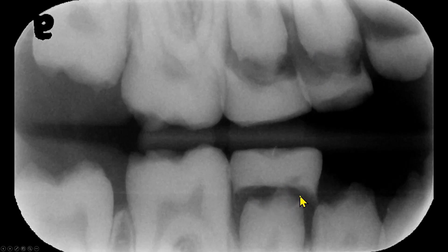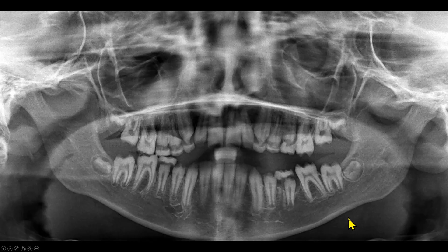We have a panoramic radiograph of the same patient. On the bitwing radiograph, we had reviewed this area. We see similar findings on other teeth.